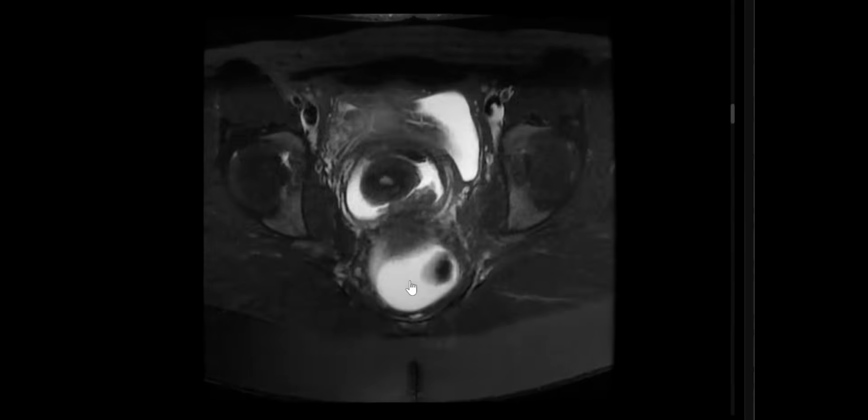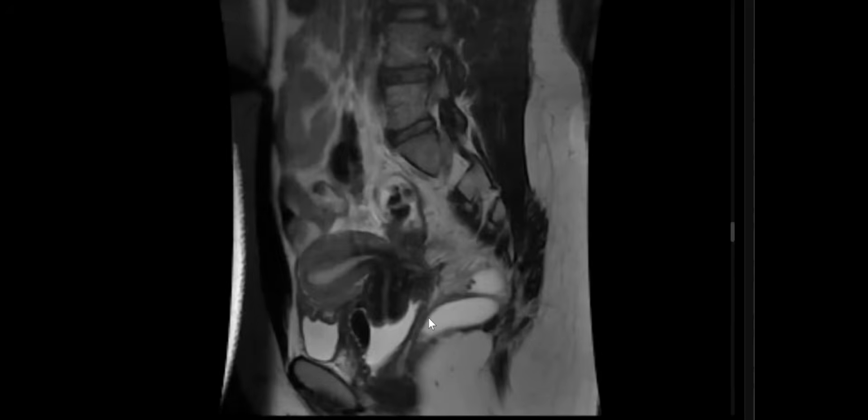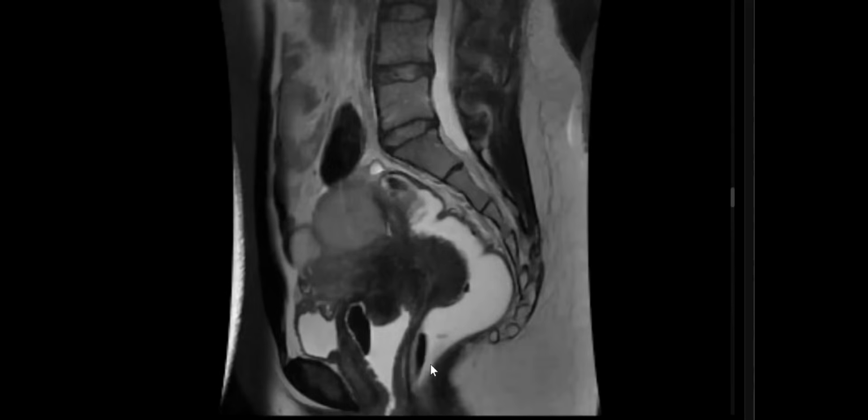You see, for the presence of any communication. This is the bladder, urine in the bladder. Here is the vagina. I injected not the usual fluid, not saline, as it will go out. Usually gel, in order to image this area. So this is some air fluid, no problem.